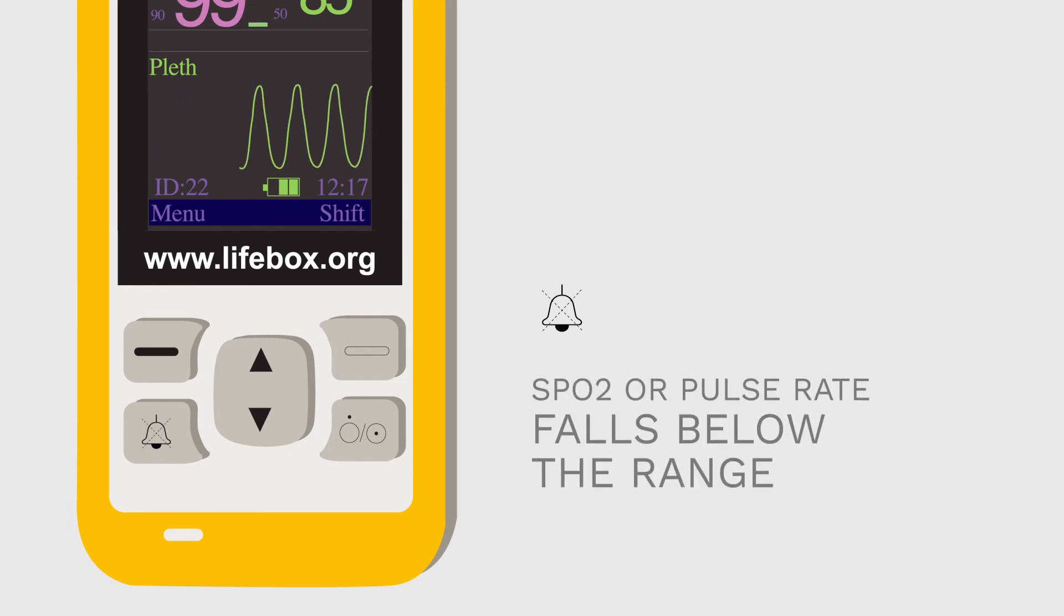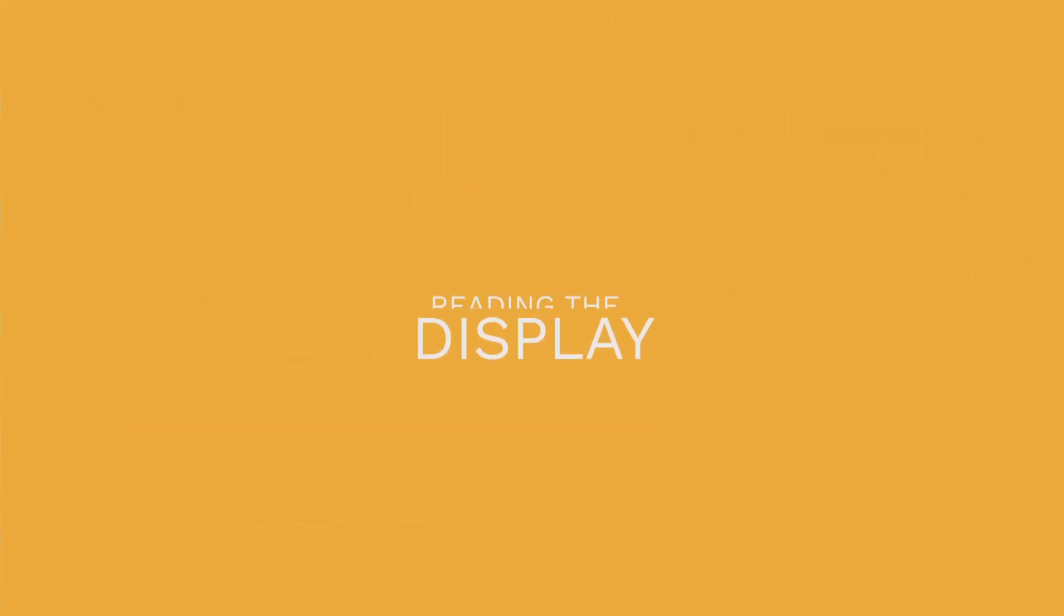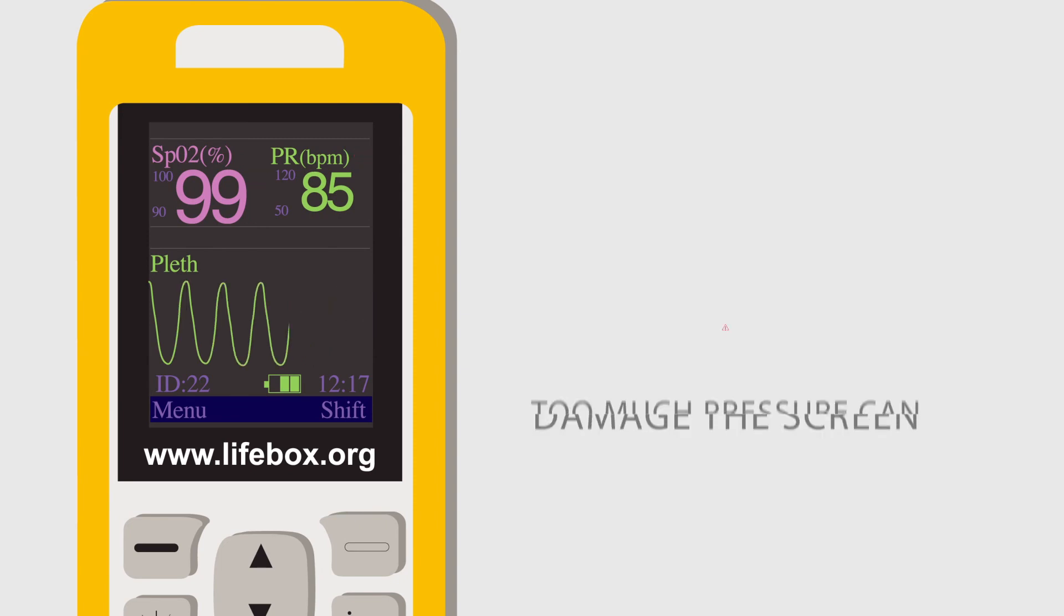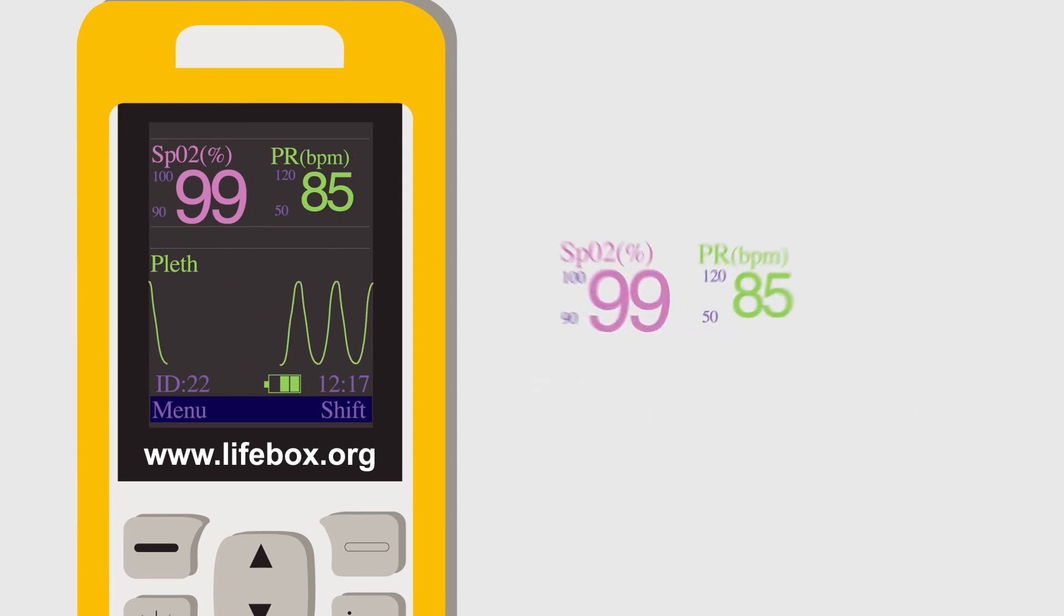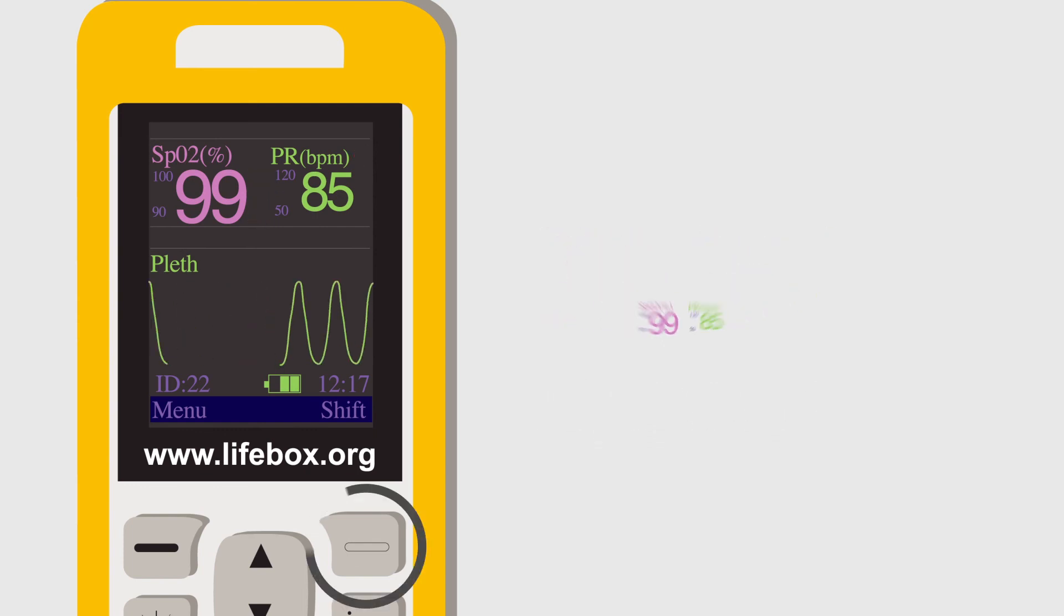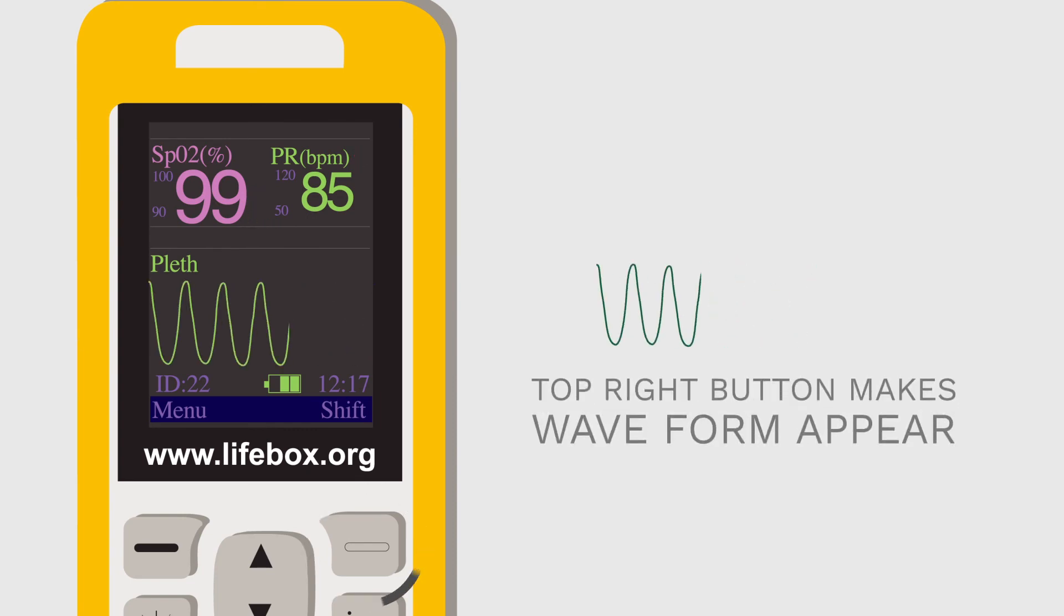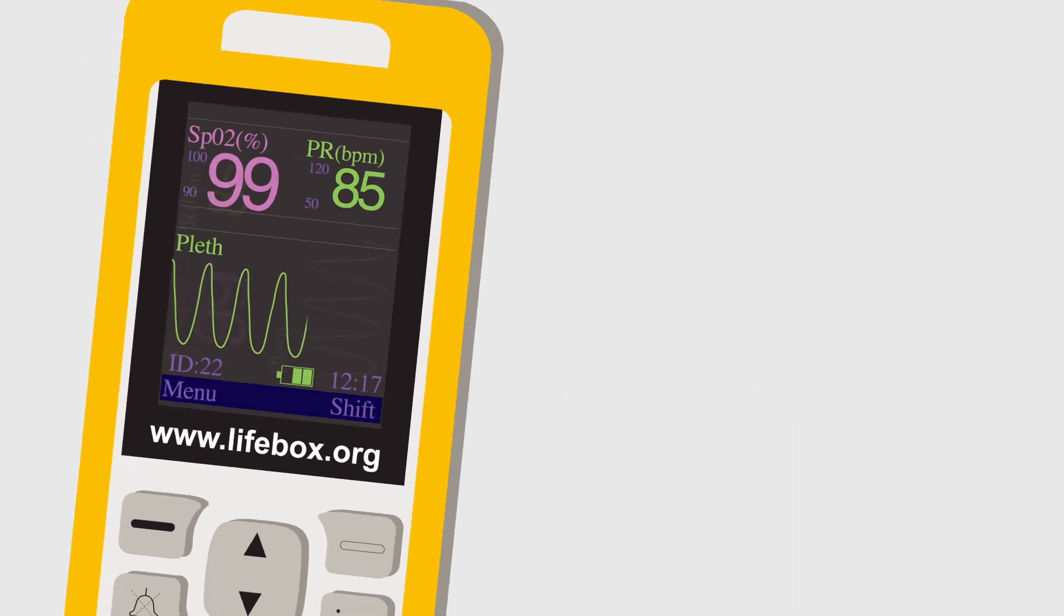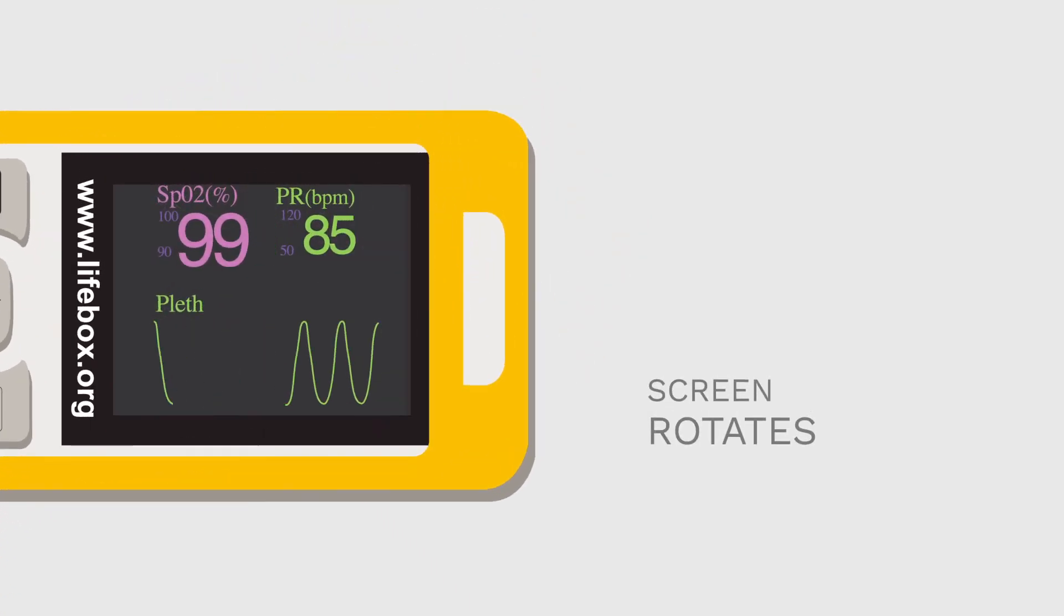Let's turn our attention to the display. There are no buttons on the display, that's important to keep in mind because too much pressure on the screen can damage it. On the display, you'll see a reading of your SpO2 as well as your pulse rate or heart rate. Don't forget that pressing the top right button will make the waveform appear. You'll also see that the screen rotates. If you turn it 90 degrees, the display information will follow.